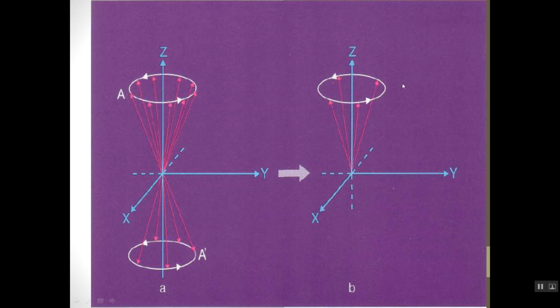But the magnetization is the summation of the protons themselves and the main magnetic field, and I can't discriminate between them. I want to detect only the signal coming out from the protons themselves, not from the protons and the main magnetic field in the z direction.